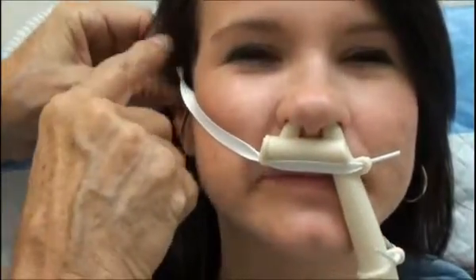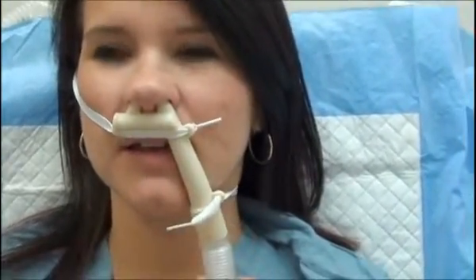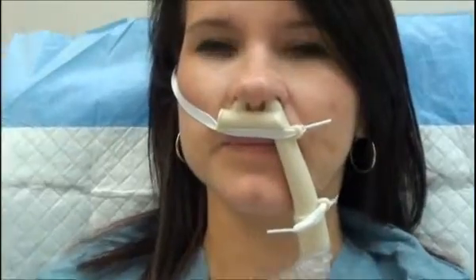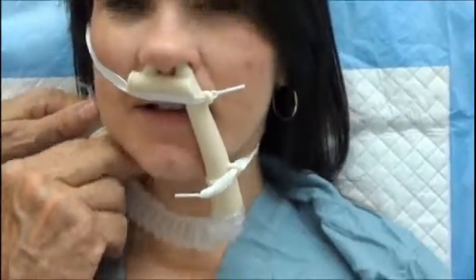I mean, it's not a normal thing to do for sure. It was easy to retract into my nose. I'm going to snug it up a little bit. Now we can bring it around this way — this is what I usually do unless I'm working on the head and neck. I bring it around this way and attach it to the anesthesia circuit.